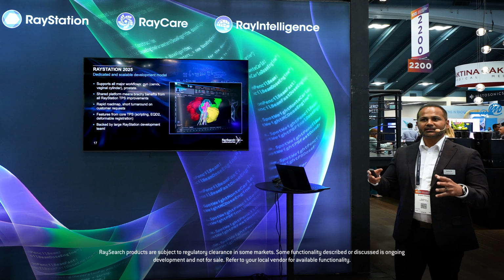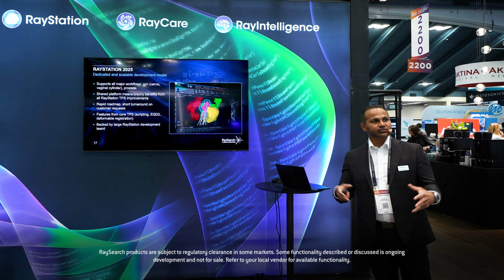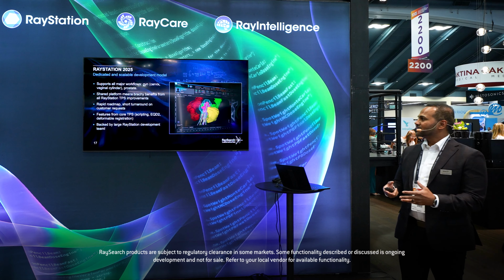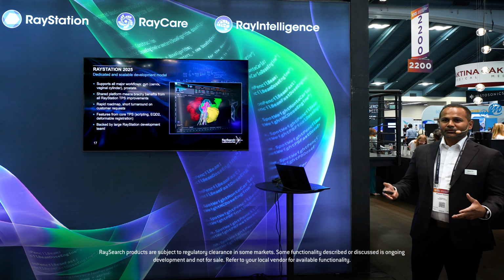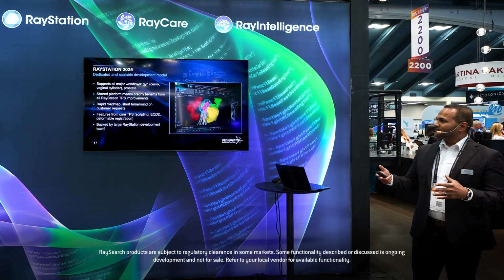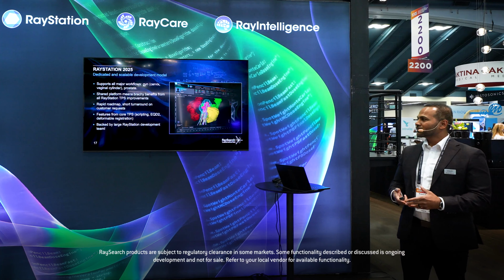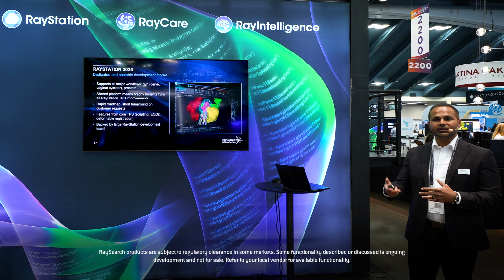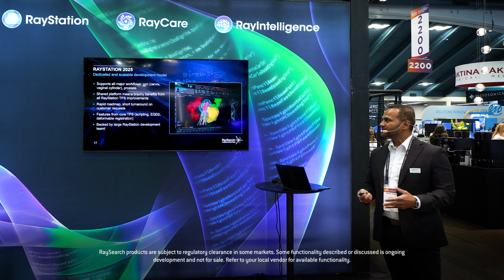The best part about having it in RayStation is that you get full TPS improvements. It's not a siloed application, it's integrated into RayStation. So any development that happens with RayStation, Brachy takes advantage of that. You're all well aware that RayStation is a rapidly developing product, so the roadmap is rapid.